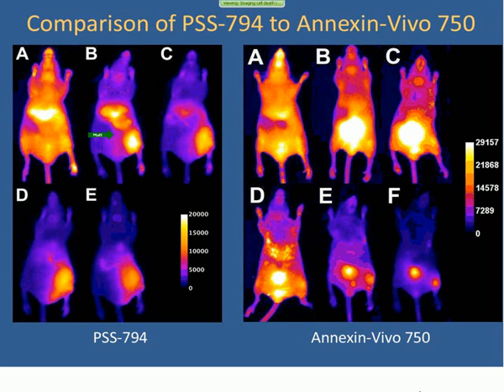So at left, you see a typical montage from our tissue damage studies, looking at an animal pre-injection and then at 3, 6, 12, and 24 hours post, and we can see the uptake of our probe. When we try to use the annexin, however, based on the clearance pathways through the bladder, we're basically unable to perform measurements at the 3, 6, and 12 hour time points. However, by 24 hours, we have enough clearance that we can visually see that we've also performed a 48-hour image, which has even further clearance of the dye, and indeed, we see the same thing.